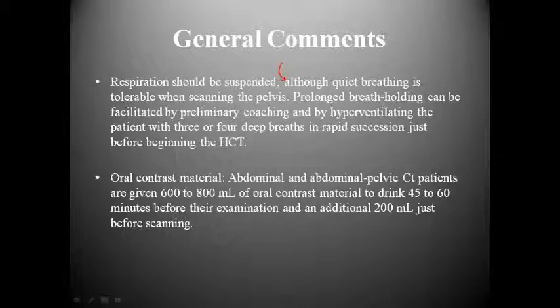Usually what I tell my patients is that if for some reason you can't hold your breath for these 20 seconds that we're going to be scanning all of this area, just kind of blow it out real gently and breathe it in real gently. And usually that'll decrease the amount of motion if there is any at all. And so the respiration is one of those big things that not everybody can do, and sometimes that has to be worked around as best you can. And so that brings us to oral contrast.